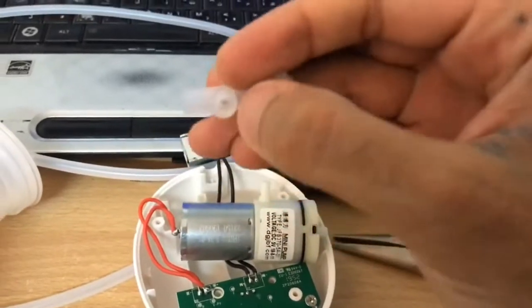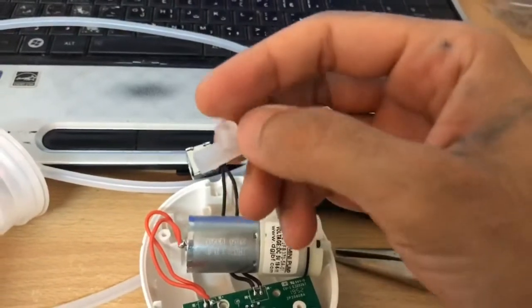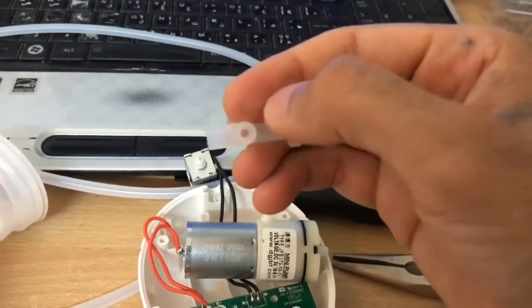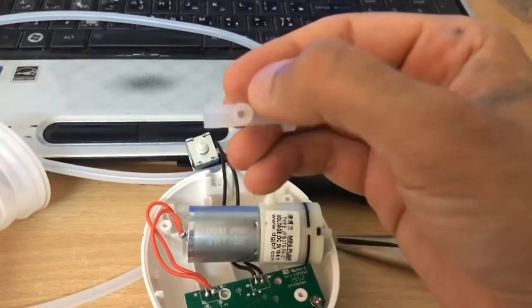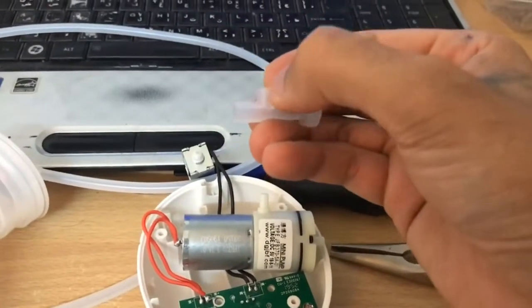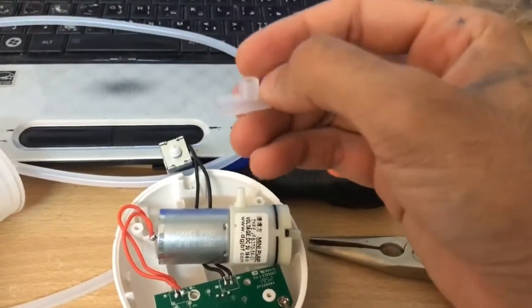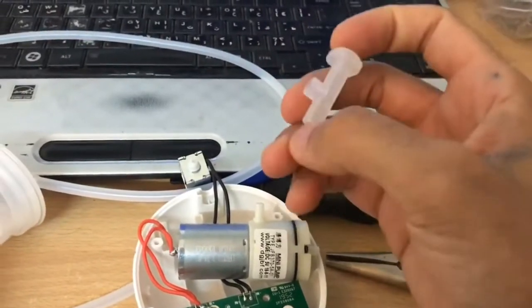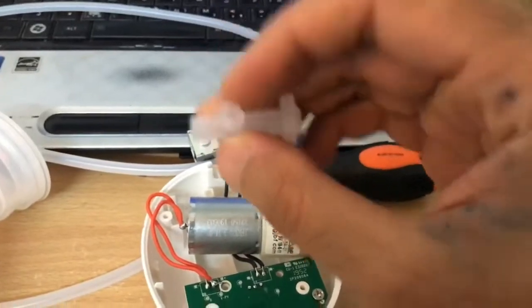This valve's opening was not open — it was sealed. It might be a manufacturing issue. What I did was take a very small screwdriver and heat it up to create the opening. You can test it yourself: before doing this, try to blow and no air goes in. Once I created the hole, air flows through properly.